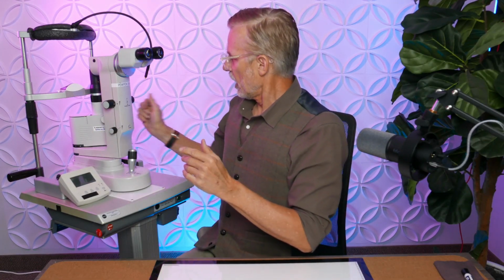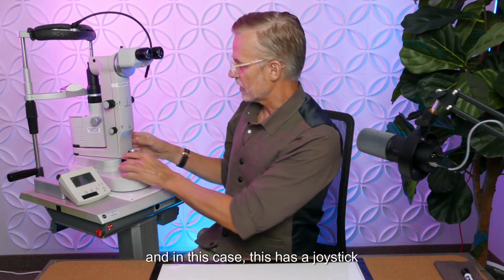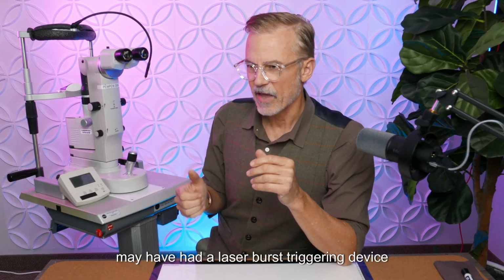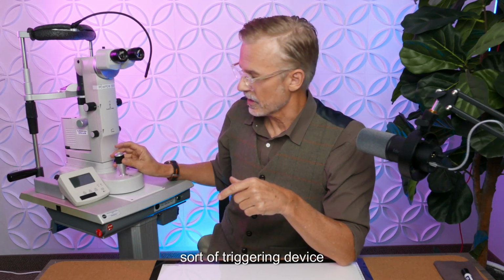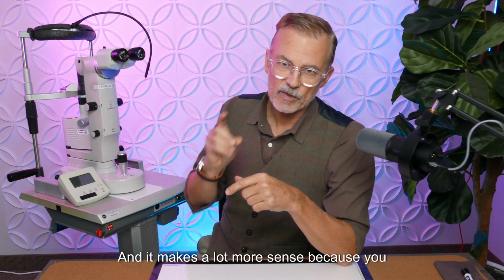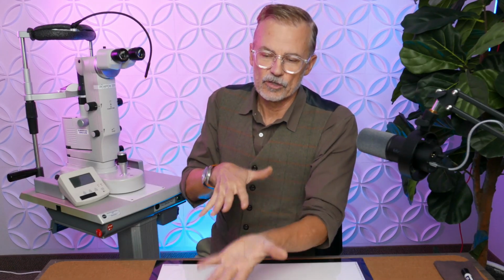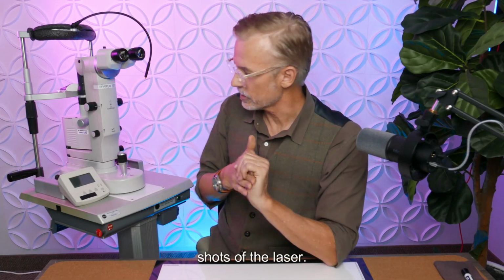And the variable beam from side to side, the laser, the optics, and in this case, this has a joystick control. I think some of the very older lasers may have had a laser burst triggering device with a foot switch. I know some of the older LX lasers did. But I think most of them will have some sort of triggering device as part of that joystick. And it makes a lot more sense because you have a lot more fine muscle control with your finger than you have recruiting large groups of muscles to use your foot pedal, and it's uncomfortable, especially when you're doing hundreds and hundreds of shots of the laser.